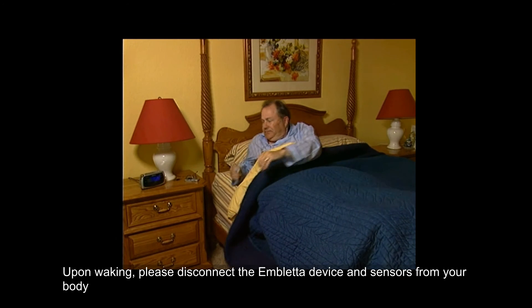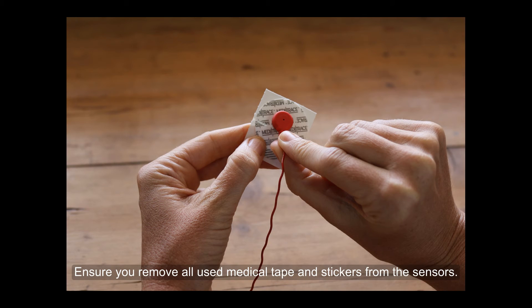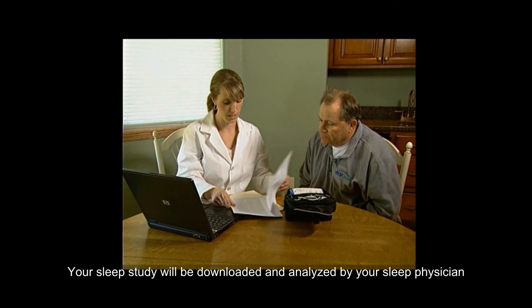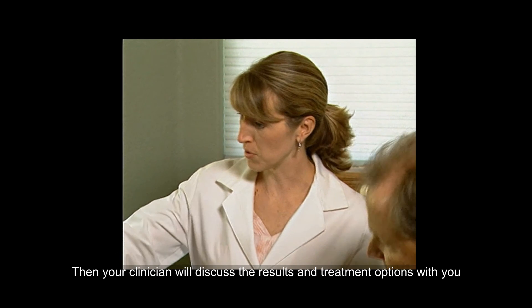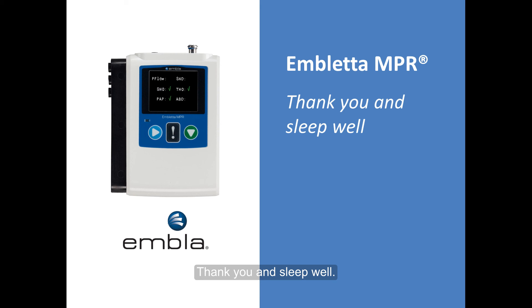Upon waking, please disconnect the Ambleta device and sensors from your body. Ensure you remove all used medical tape and stickers from the sensors. Your sleep study will be downloaded and analysed by your sleep physician. Then your clinician will discuss the results and treatment options with you. Thank you and sleep well.